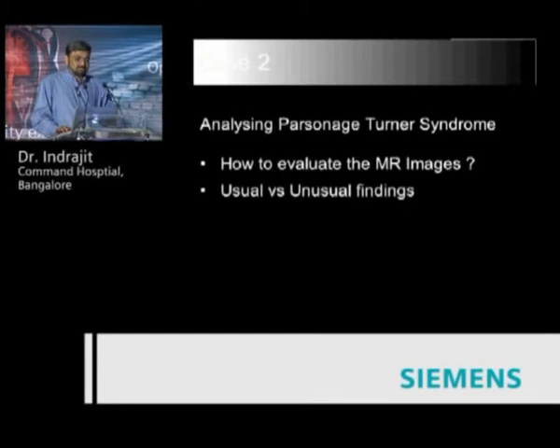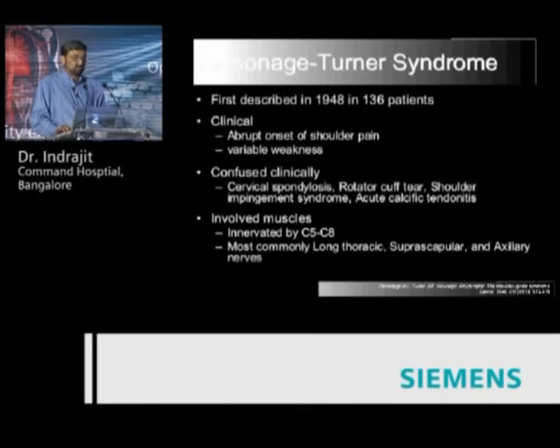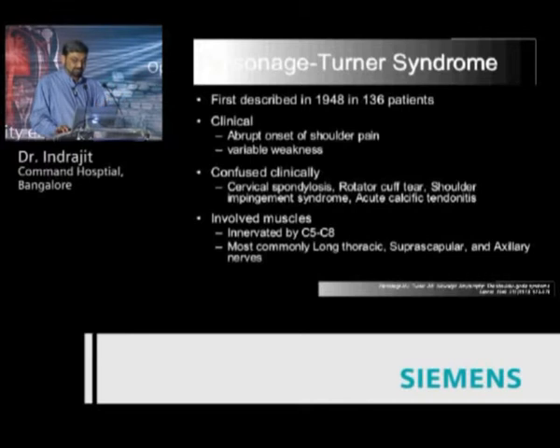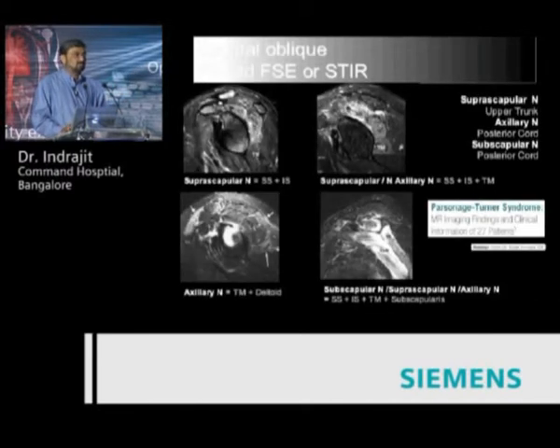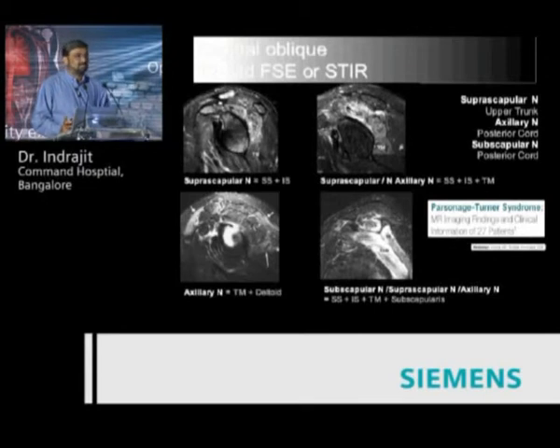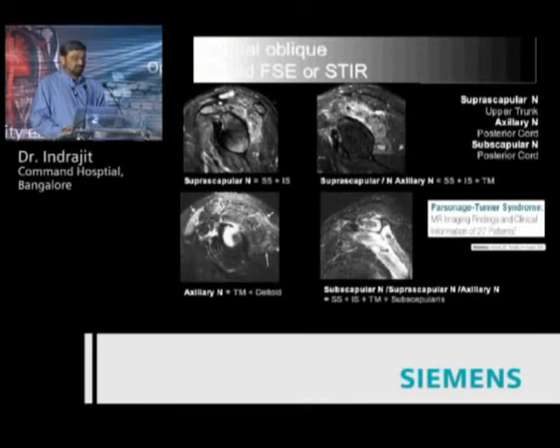Let us analyze Parsonage-Turner syndrome using this case. This syndrome was first described in 1948 in a series of patients, characterized clinically by an abrupt onset of shoulder pain with variable weakness, and often confused clinically with a variety of shoulder entities. The involved muscles are innervated by the C5 to C8 roots. The sagittal oblique image is what was described in this particular article, but one can use axial and oblique coronals to analyze more clearly in the early stages of learning.